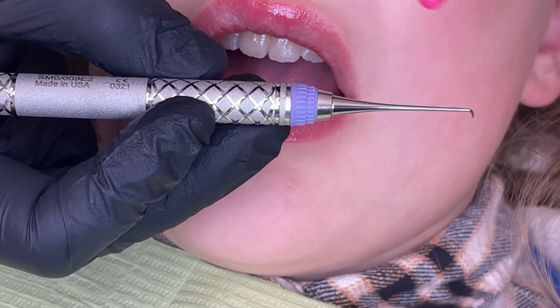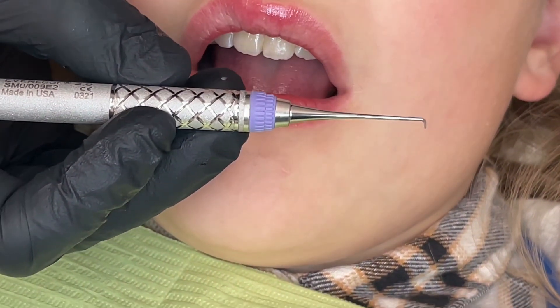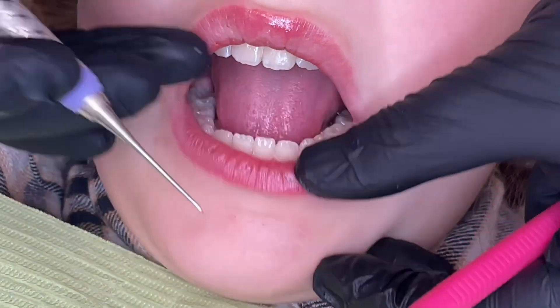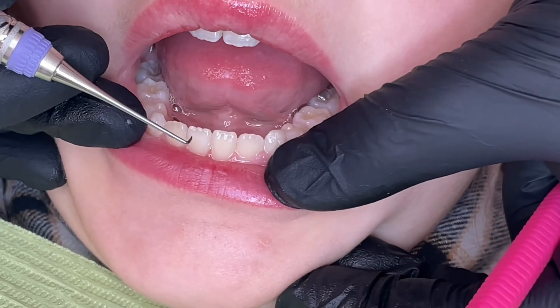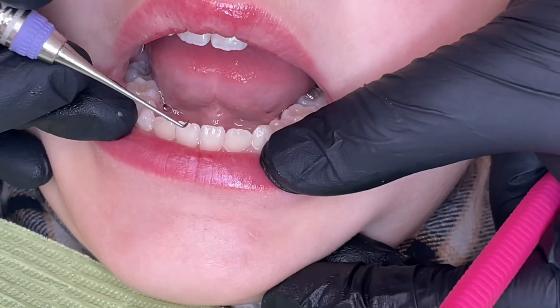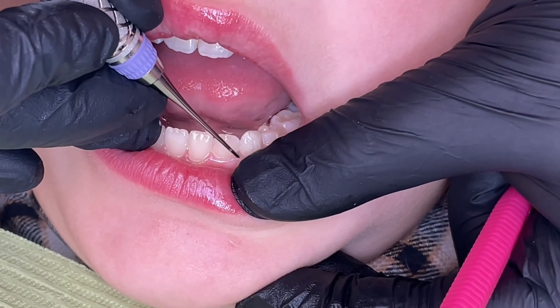But this is great if you have a patient with crowded anteriors, ortho, or pedo patients — it's really helpful for those. So this is our pedo patient today. She's currently in Invisalign ortho, so these teeth aren't fully erupted yet. They're getting into place, but this is great for these tight tissues to work around.